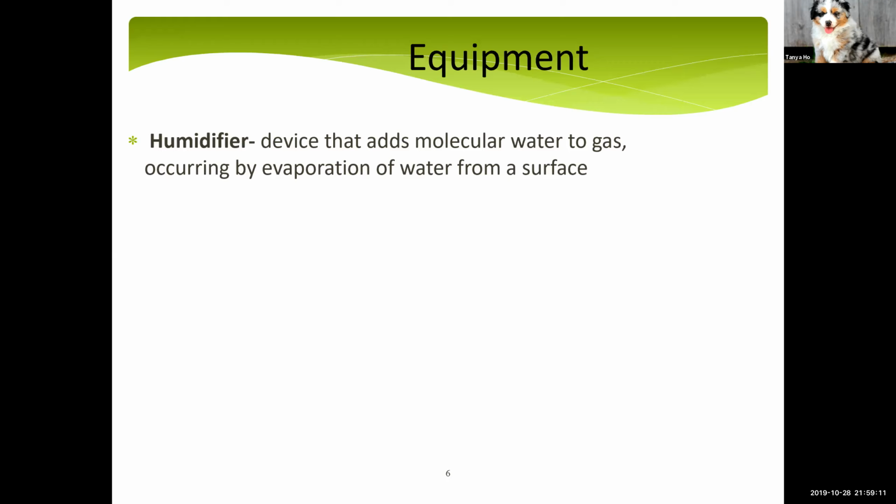Okay, so in terms of how do we deliver humidity? Well, we have what is called a humidifier. Okay, and so these are different devices that add water vapor to a gas. Okay, and so we have different types, which we'll go into.